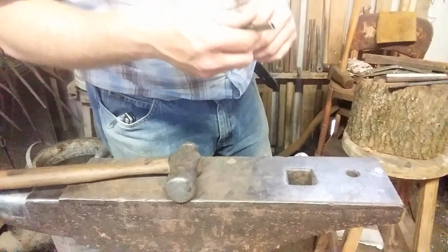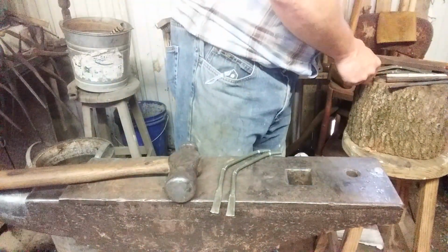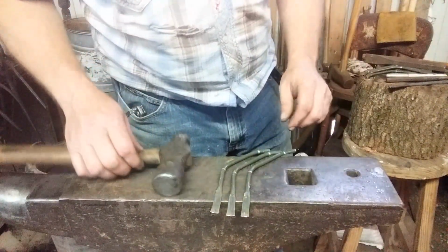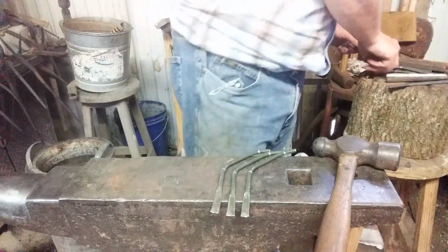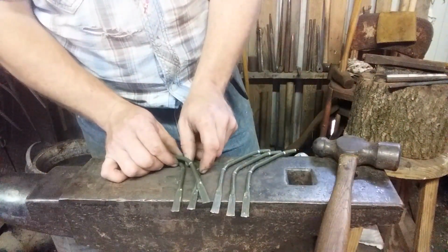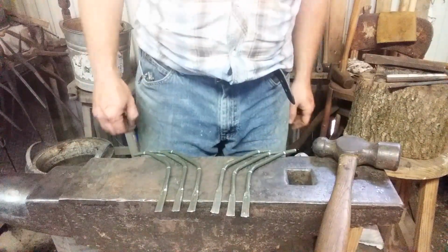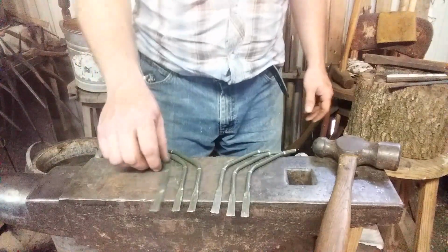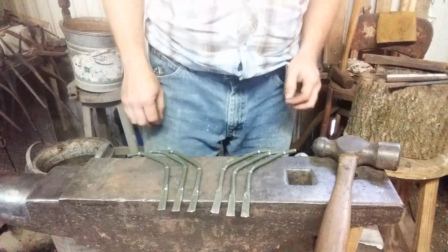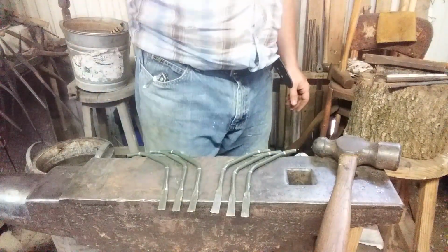Okey dokey. Make sure that I got everything like I want it. Got 3 offset to the left. Got 3 offset to the right. That's great. This one looks like it's a little lumpy in the middle. I can tweak it all once it gets where I want it. So I'll take a pause and I'll see you in a minute.